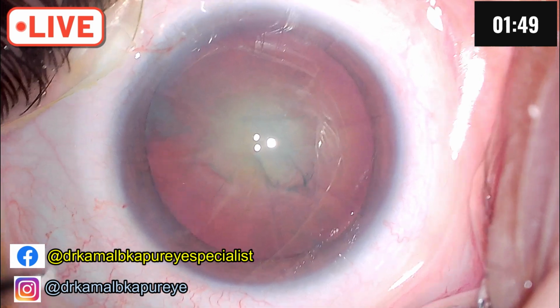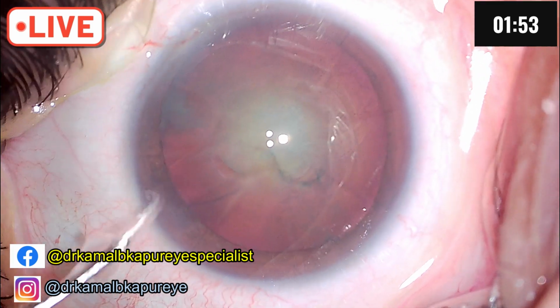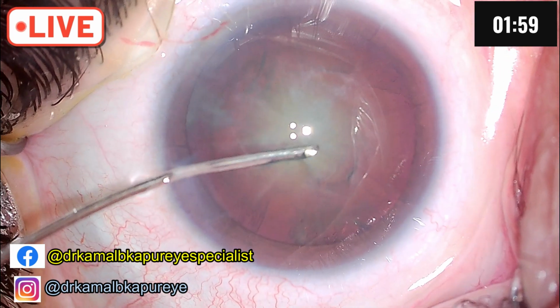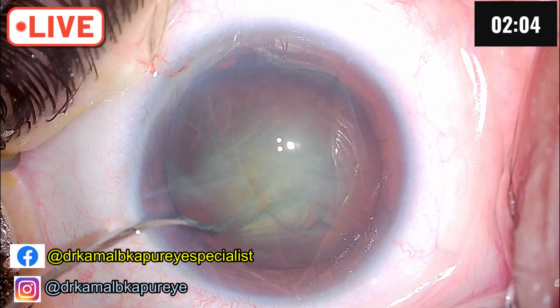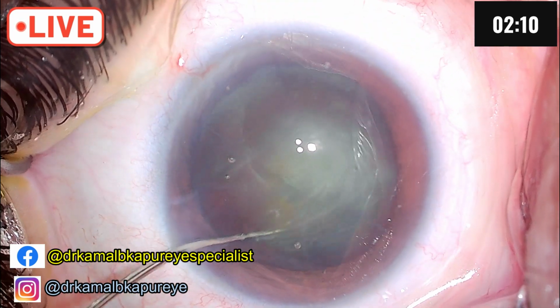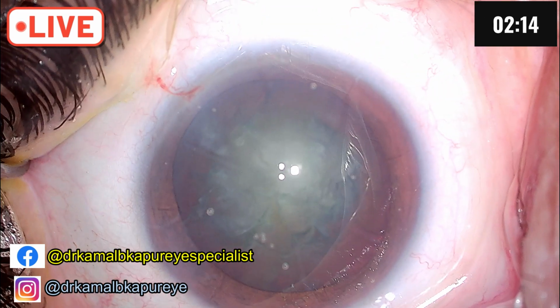Another thing to incorporate is to make sure you use the Barrett True-K or any modified formula which is recommended for post-RK patients. The flattening in RK is total and universal across the cornea, unlike LASIK, where the flattening is only in the anterior cornea. Now, we will have to make sure there is no sudden increase or decrease of anterior chamber depth.